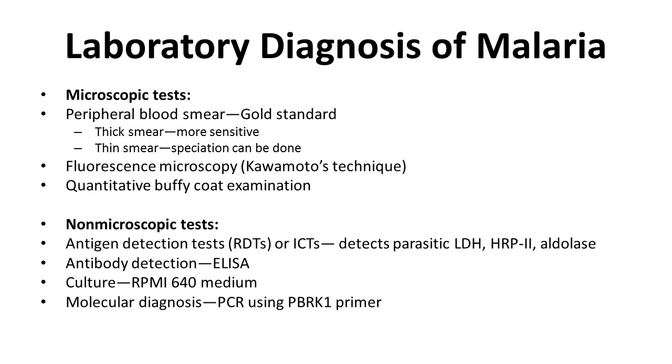Why can we not detect the species in a thick blood film? Here, after preparing the thick film, we have to air dry it fully. Then we have to go for dehemoglobinization. In dehemoglobinization, what is happening? Normally in our blood the RBC number is very high.